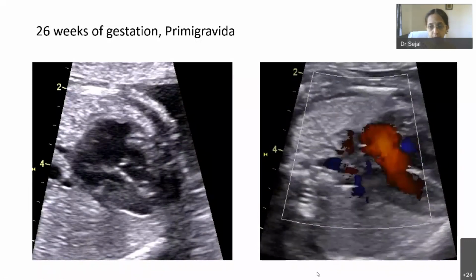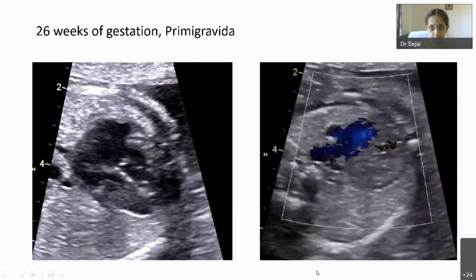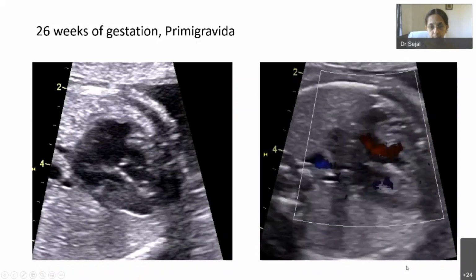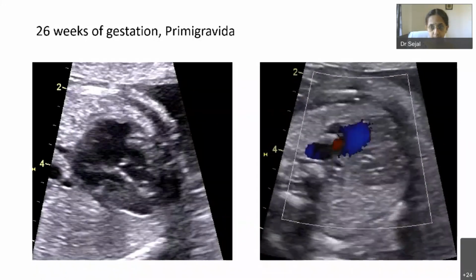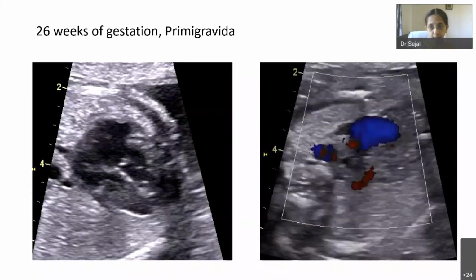Can you all see the video? Do you want to go to the 2D image once again?